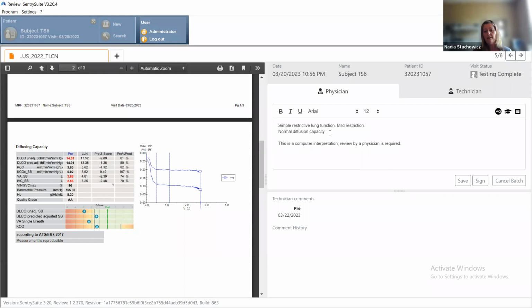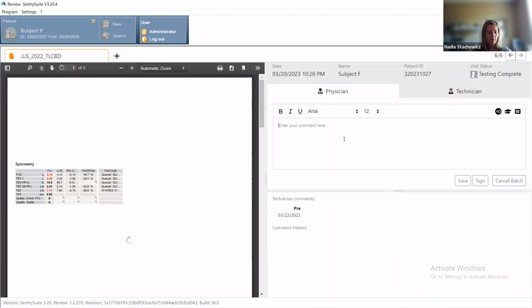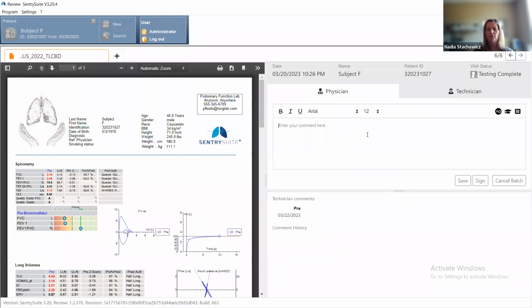So, you know, that's actually one of those things to consider when looking at this. Do I need to grab a hemoglobin on this person? And of course, you also see it here again in that really nice graphic representation. And I think we probably have time to do 2 more of these. Let's see if I select my icon.